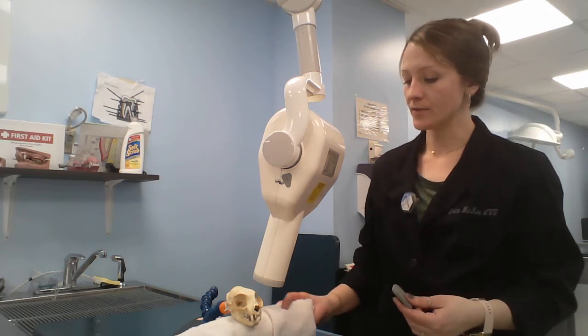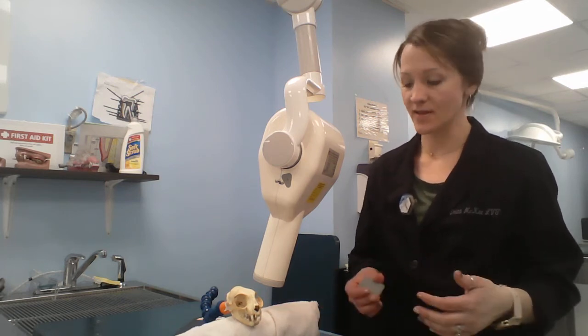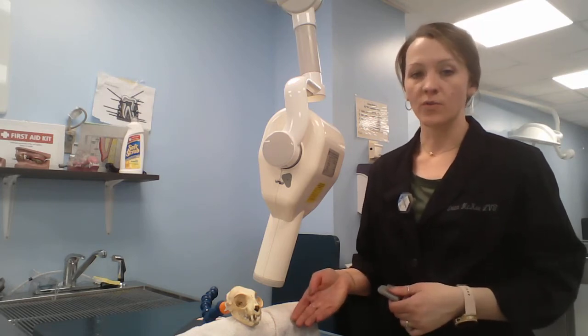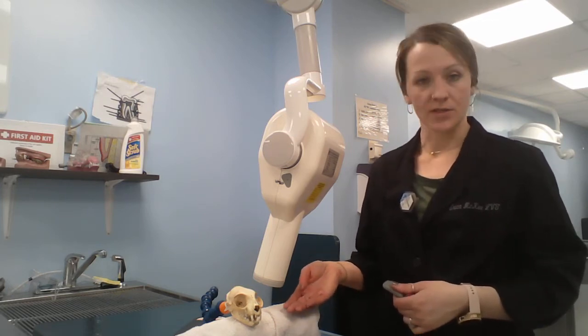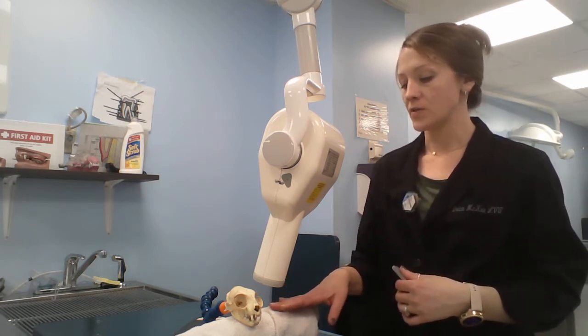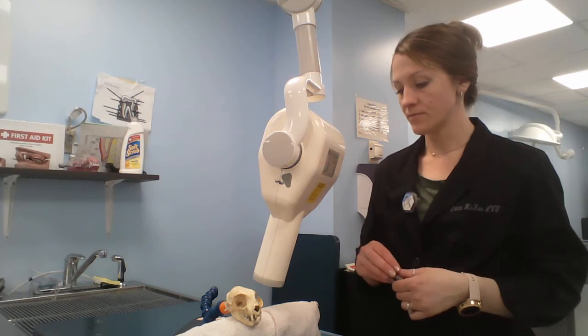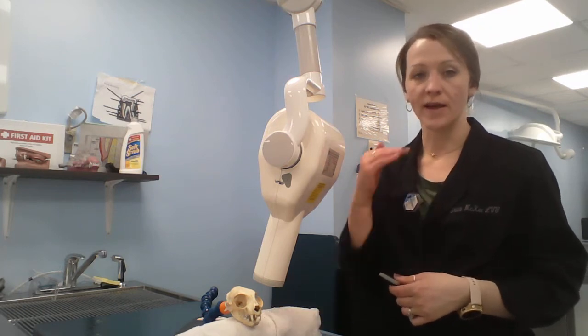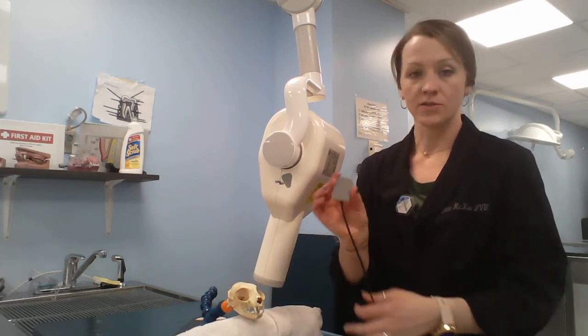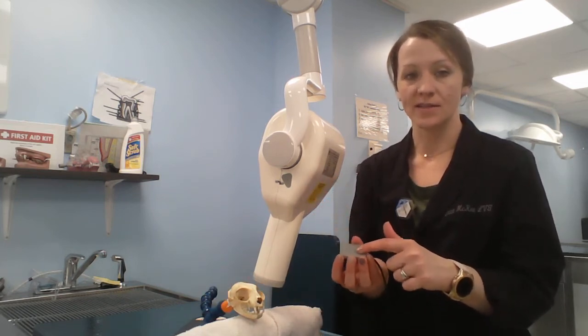The only better part, like I said, is there are fewer teeth to examine, so there are fewer x-rays that we can take, so it goes a little quicker. So we're going to start with our cat in ventral position. They've been anesthetized, they've been intubated, all that stuff. We're going to start with them in sternal position, putting a rolled towel under the head to elevate it and bring it up so it's a little flatter.